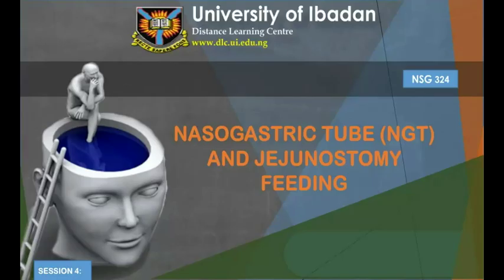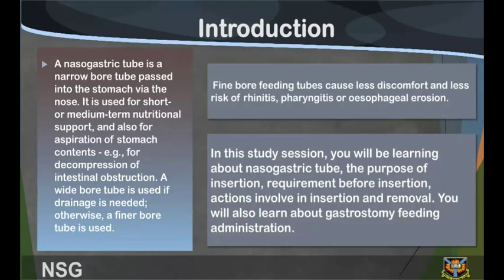Welcome to study session 4, Nasogastric tube, NGT, and Jejunostomy feeding. Introduction. A nasogastric tube is a narrow bore tube passed into the stomach via the nose.